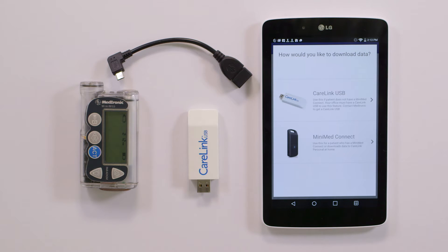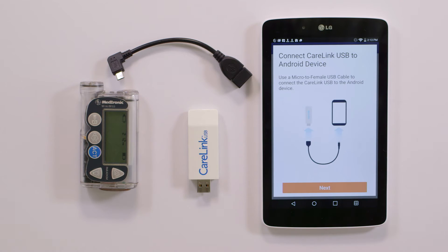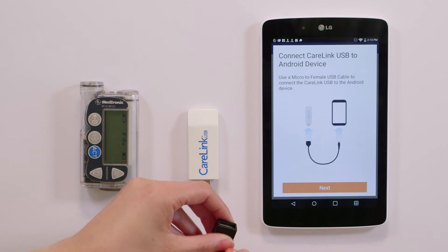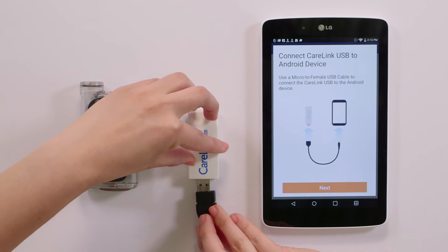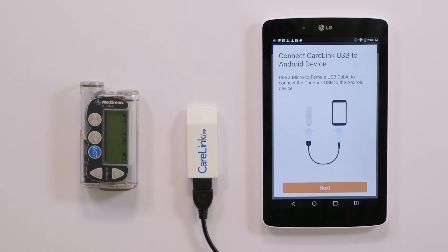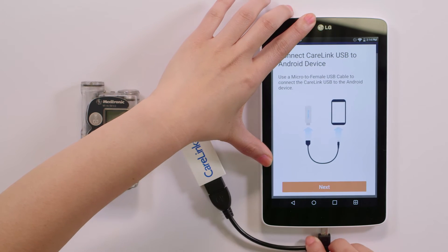Tap CareLink USB to see detailed steps on how to connect the necessary pieces to download your patient's Medtronic pump. To complete setup, connect the female end of the USB cable with the male end of the CareLink USB device. The micro end of the USB cable will be put into the tablet.